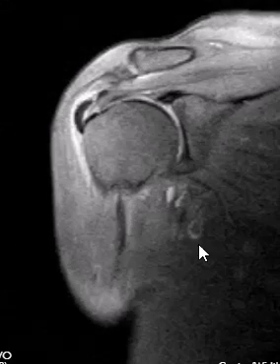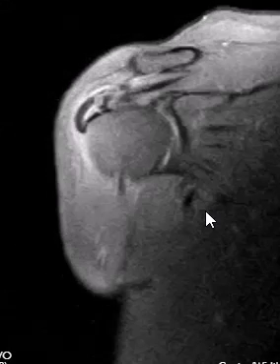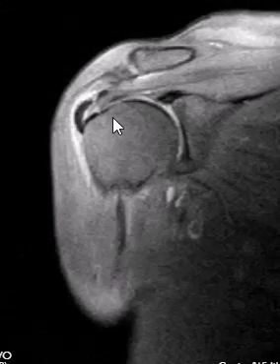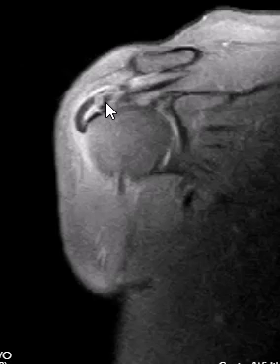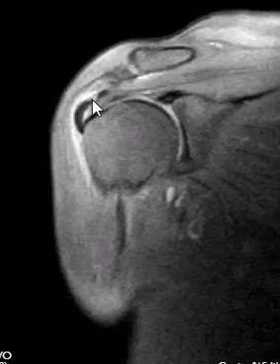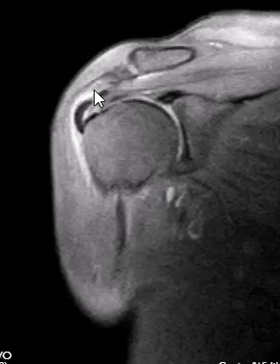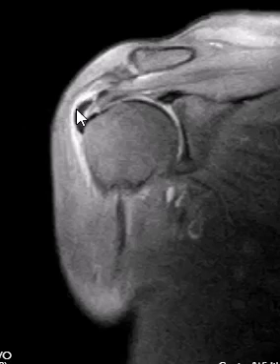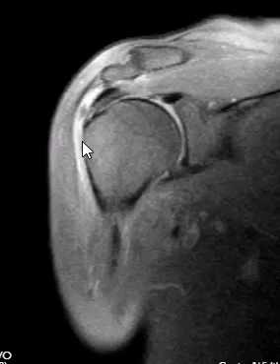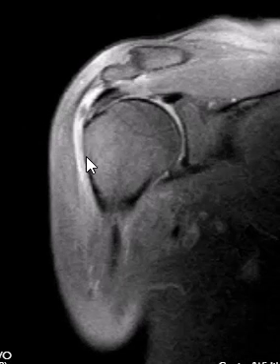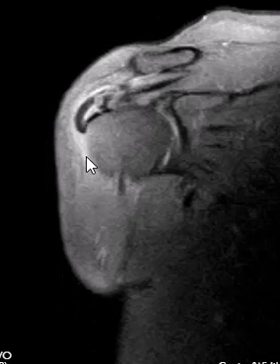This is a coronal PD fat sat image. Now we can see these calcific deposits are kind of amorphous, curvilinear bands. And over the top we see this brightness — this is inflammation of the subacromial subdeltoid bursa.